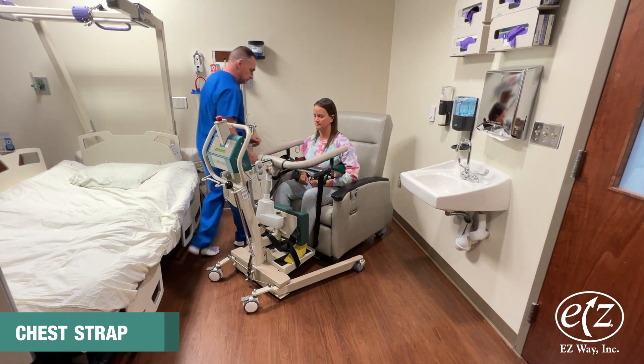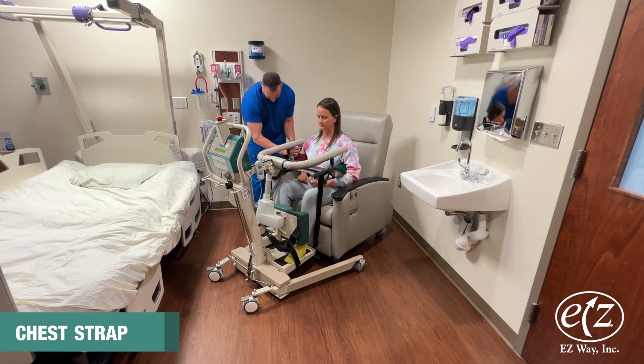Follow the operating instructions to attach the easy way harness and raise the person in the stand.